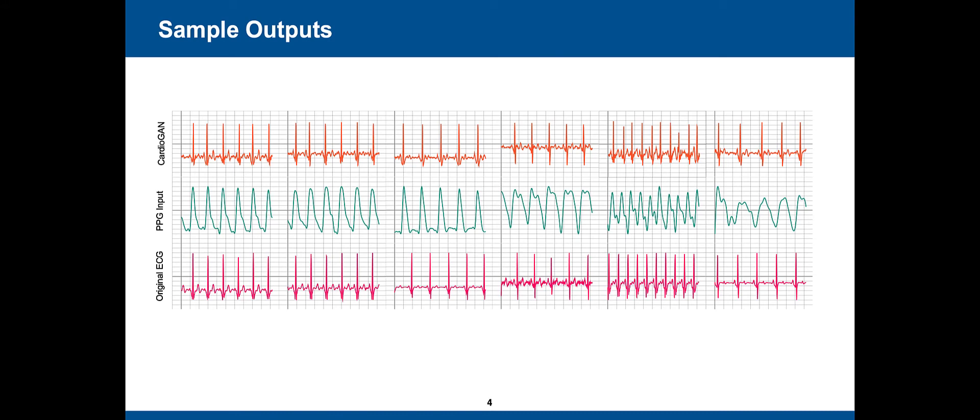Here, we present several sample input-outputs along with the ground truths. The topmost row shows the ECG generated by CardioGAN, the middle row presents the given PPG inputs, and the ground truth ECG is presented at the bottom row for reference.